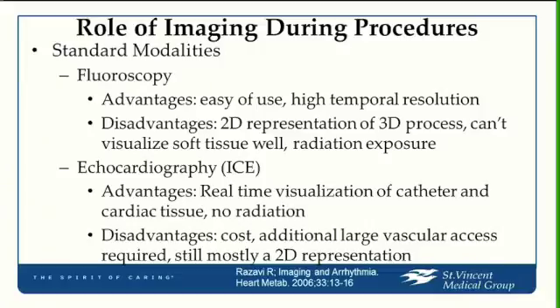So basically, the way this came about was we started doing ablations on the left side of the heart, in the left atrium, or the left ventricle, or for accessory pathways. Because if you remember, 20 years ago, the only really ablations we did were AV node reentry and accessory pathway Wolff-Parkinson White ablations. And sometimes we wanted to go through the septum, transseptal, to get to the left atrium so that we could ablate left-sided accessory pathways, because most accessory pathways are on the left side. And you could either go across the aortic valve retrograde, or the other way was to go transseptal. The trouble is, 20 years ago, EP didn't know how to go transseptal. We'd always have to call a cath guy in, usually an older cath guy who had done transseptal caths.